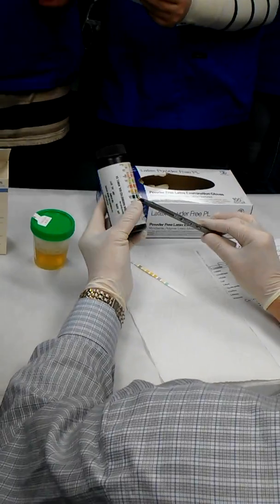So, let's go further. Specific gravity. So what is specific gravity? Specific gravity of urine. Okay?